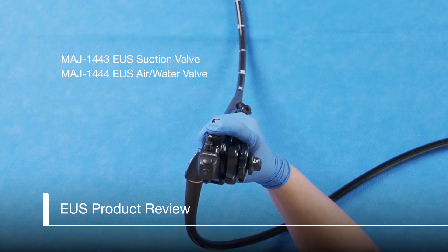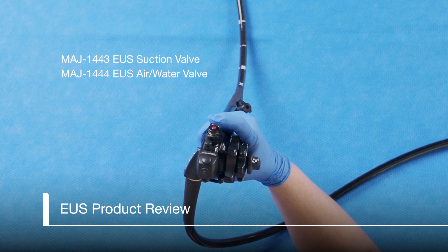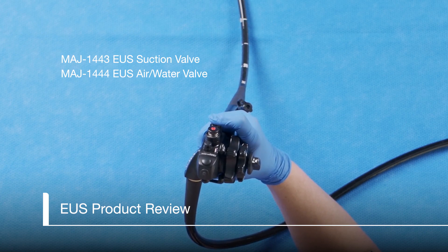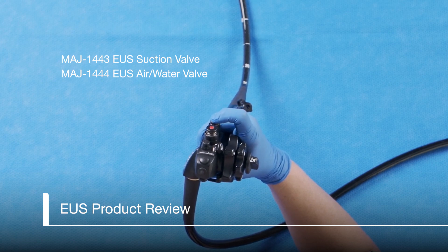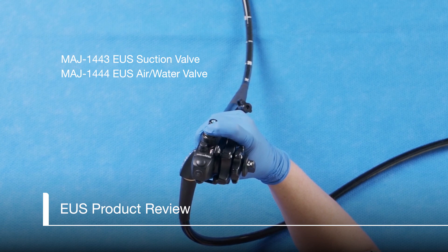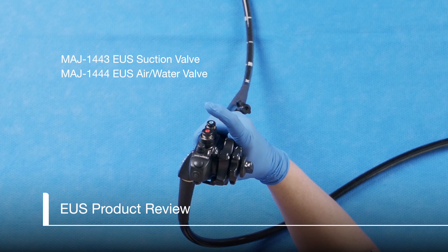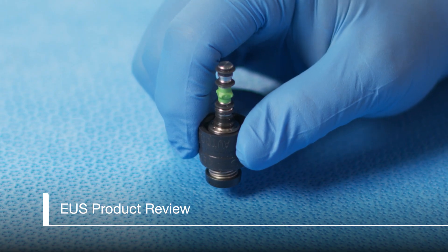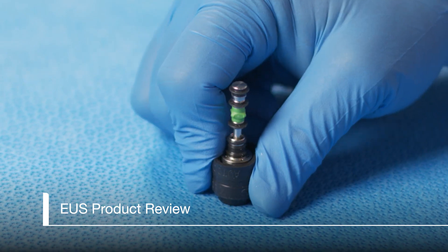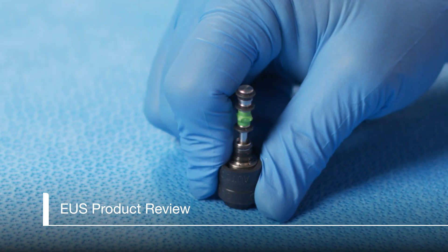Let's start by looking at the function and details of each product to ensure you are familiar with the design features and how they work. EUS valves are two-stage valves. Often, when the valves are new, they need to be primed. We can do this by pressing the valve button completely down several times to confirm it moves smoothly. If the button is difficult to press completely down to the second stage, turn it upside down and press it firmly down on a hard surface.